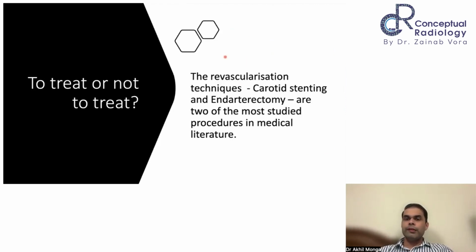So now if you see some stenosis, maybe if you've done carotid Dopplers, you might say that some amount of plaque is always there, small, big, sometimes 10%, 20%, 30%. Should we start treating everything? Can any plaque go up? So that is where the discussion comes in now.